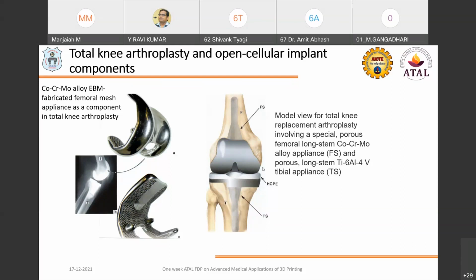These are commercial biomedical devices, and 3D printing is very advantageous and beneficial when you consider these kinds of biocompatible materials for hip implants using the ASTM F75 standard with FDA approval. With post-HIP treatment, that is at 1200 degrees centigrade, HIPping can be done for a 4 hour duration with 0.1 gigapascal of argon pressure.